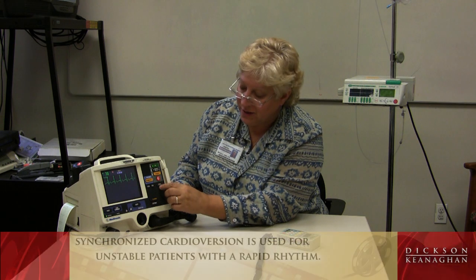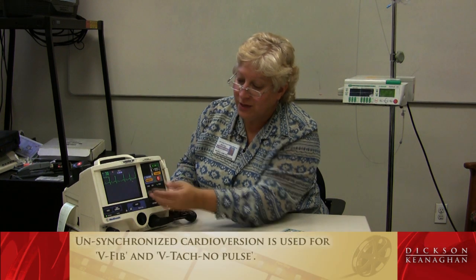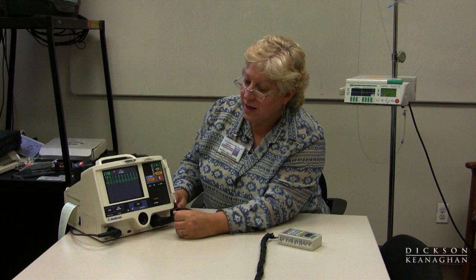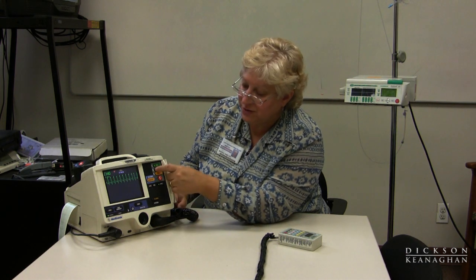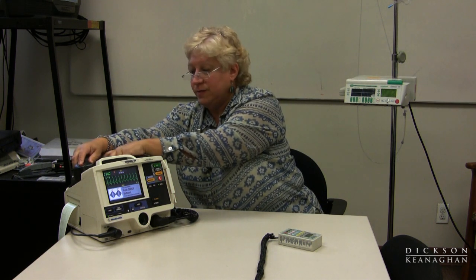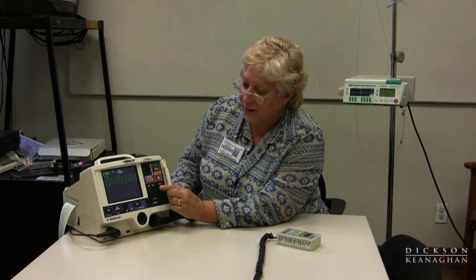For a synchronized cardioversion: step one, step two is energy select, step three is charge. I can press the sync button at any time and it will highlight the upstroke of the R wave. We usually do cardioversion in a fast rhythm when a patient is unstable, and the energy delivered is usually a lesser amount — fifty to a hundred joules as an example. After delivering energy, note that the synchronizing goes off. So if I need to do another synchronization for a patient in ventricular tachycardia with a pulse, I would have to press the sync button again, and it flashes on the R wave.